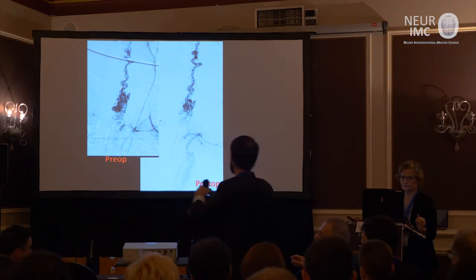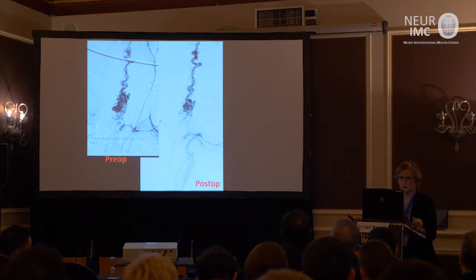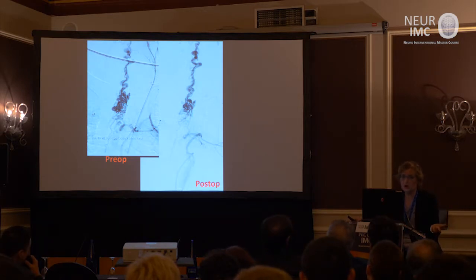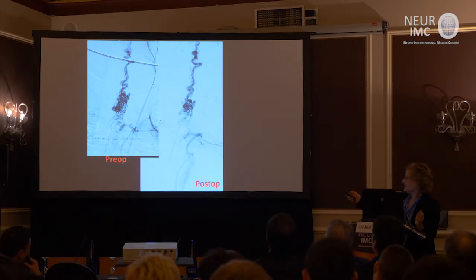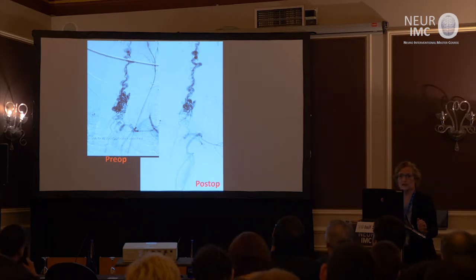The patient had only pain, not bleeding, no? No. Okay. Why do you think the patient improved? Why improve after this embolization? Is it the vein? Is it the aneurysm? The pain might be because of the aneurysm. That's what we thought. And we decreased the flow at least a little bit. I don't know how much, but here it looks like we decreased the flow a little bit. So we thought it may have helped.